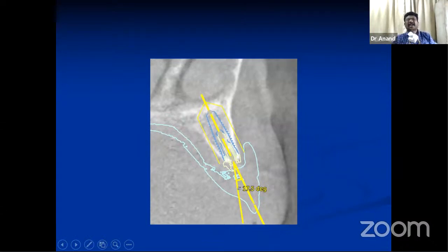So these are excellent applications of these third-party images, and not only do they help us to know the position, but also what size of abutment. So before you procure, you ask the surgeon to procure only this size of implant, this size of angled abutment, because each and every inventory item is very costly. You cannot buy everything and keep it and try it for each patient. So you would have an adequate plan and then you execute it properly.